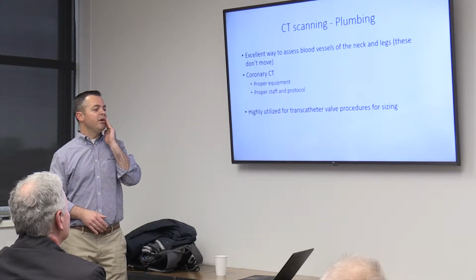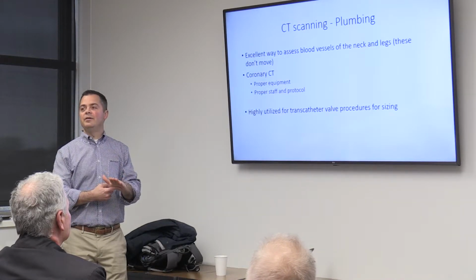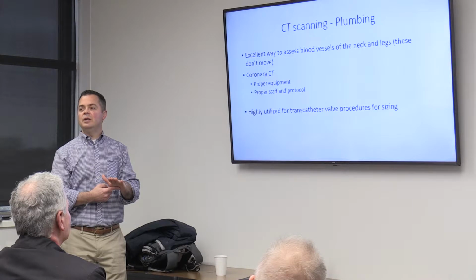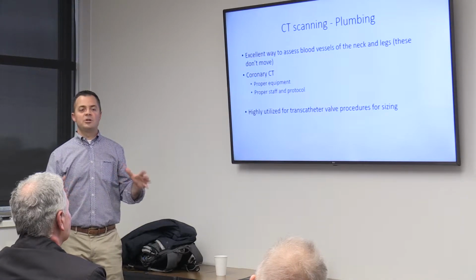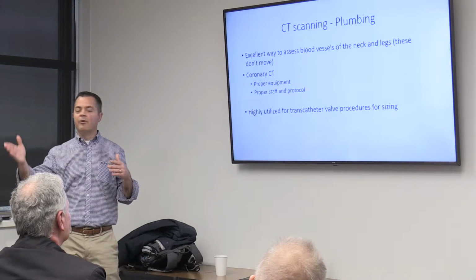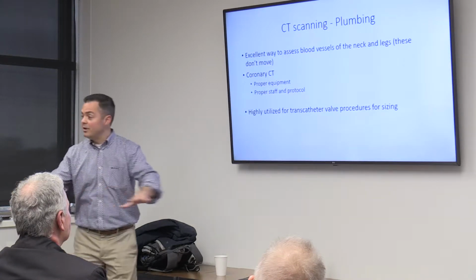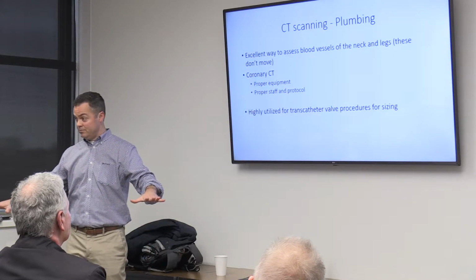We have a really amazing CT scanner here that is ridiculously fast. Historically, CT scanning's been around a long time. I could take a CT scan of your liver, no problem. I could lay you on a table and just say, hold still, right? And your liver's not gonna move.